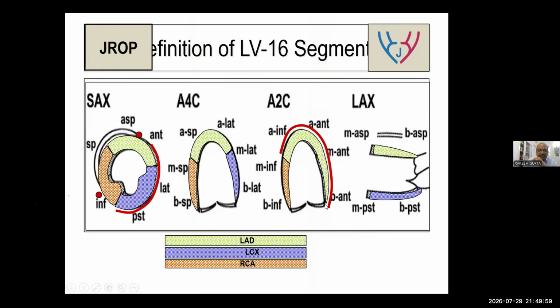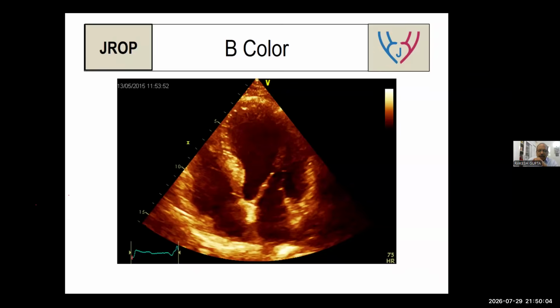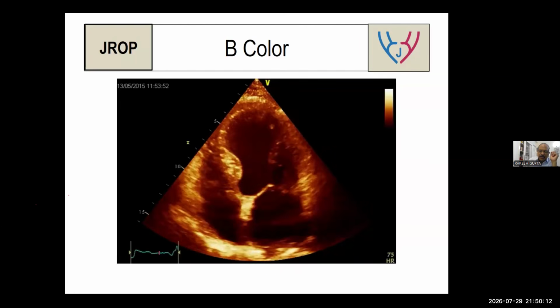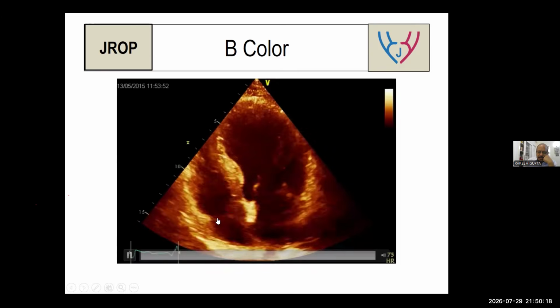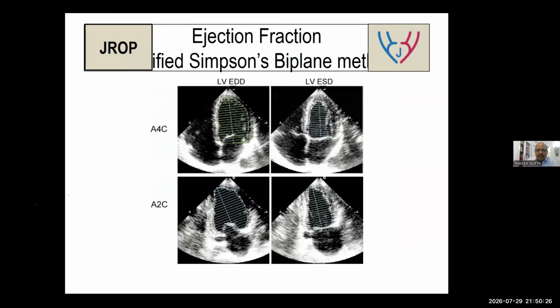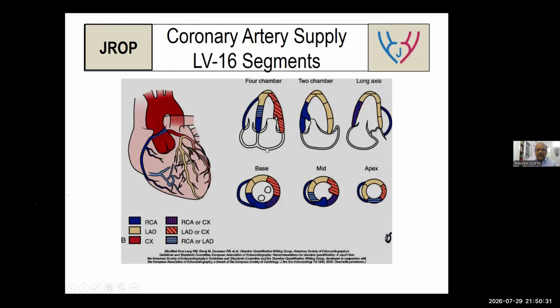And at the same time, when we talk of wall motion abnormalities, when we talk of 16 segment models, the most important thing you should remember is we have to look at the contraction of RV function, which could be by TAPSE, or RV free wall TDI, or a strain image. So at your level, if you do it by TAPSE, that'll be great. And if a patient of inferior wall MI comes, we always have to look at RV free wall TDI, TAPSE. Because that's one condition where we don't use drugs which reduce the preload.